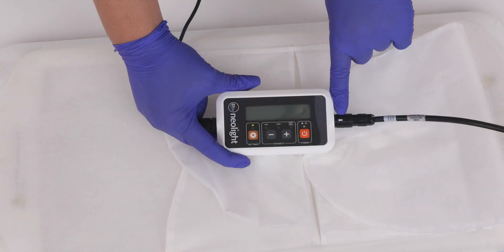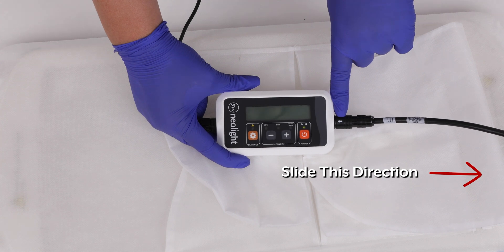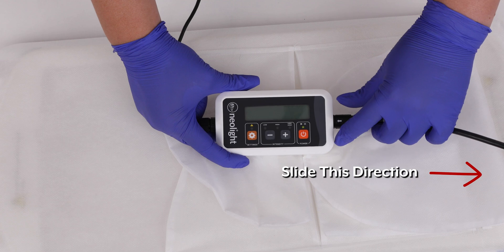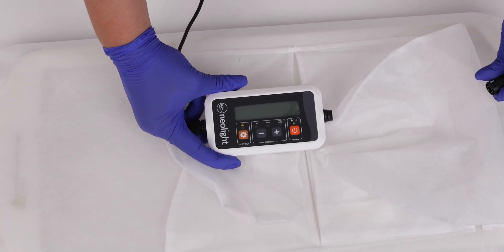In order to disconnect the controller from Skylife, you will need to slide the cable sleeve away from the controller until it hits a stop. Once the sleeve hits the stop, you can easily slide the cable out of the controller. You may find it difficult to remove the cable if the sleeve has not slid down the cable enough. Do not attempt to force the cable out of the controller.